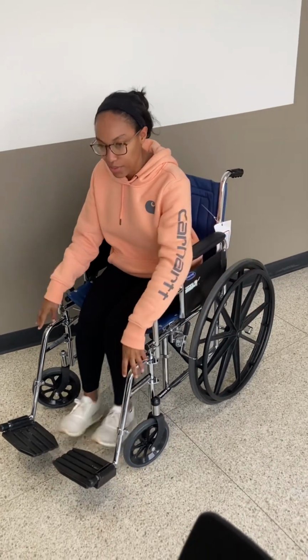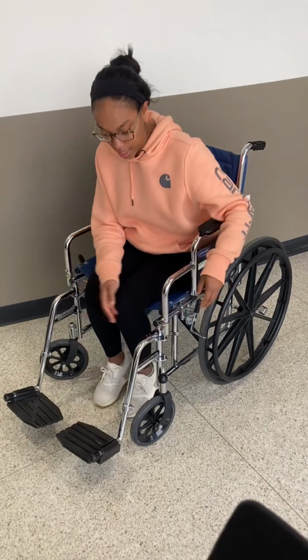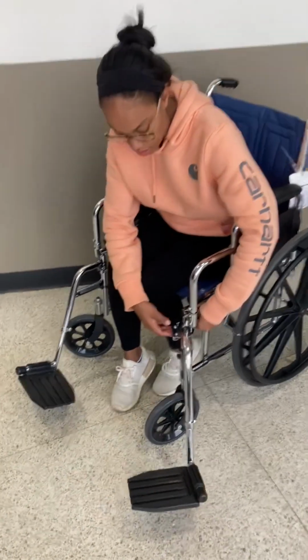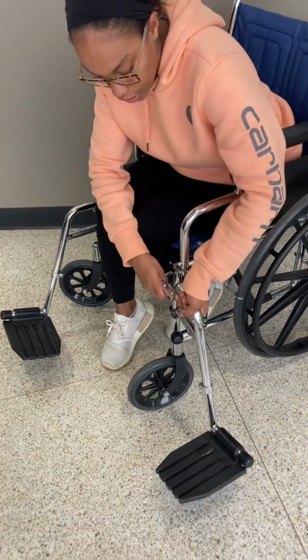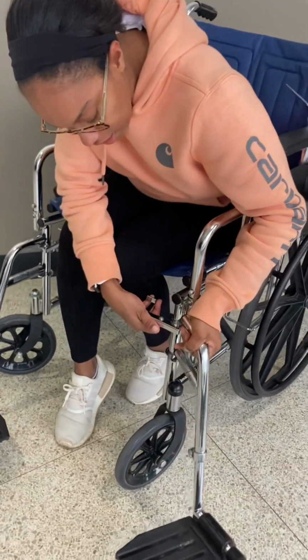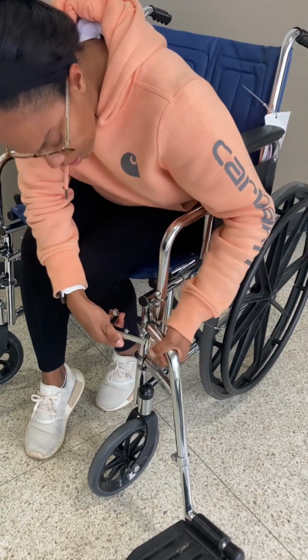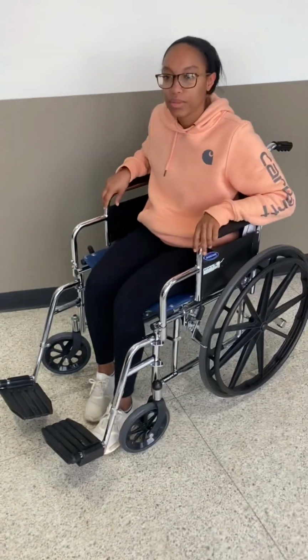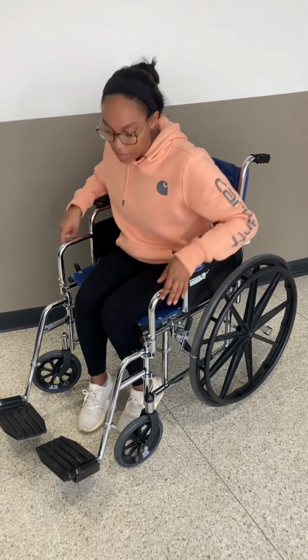Go. Okay, so now we're going to talk about the components of a wheelchair. You have your leg rests right here. They can come off and on. To detach them, you're going to want to lift this lever and just lift up. And to reattach them, you're going to line the holes up, put them through and close. And that's how you attach and reattach them. These ones currently don't adjust.